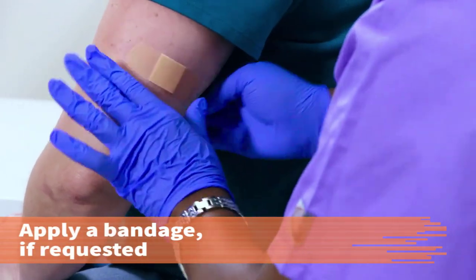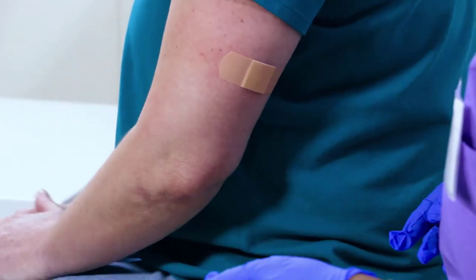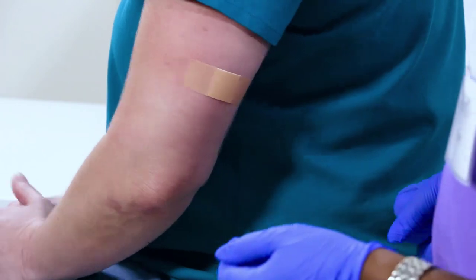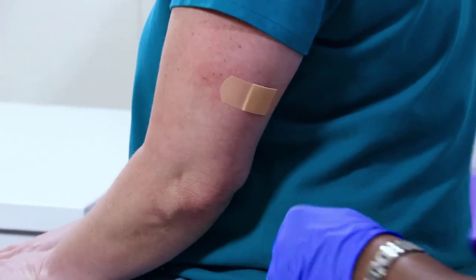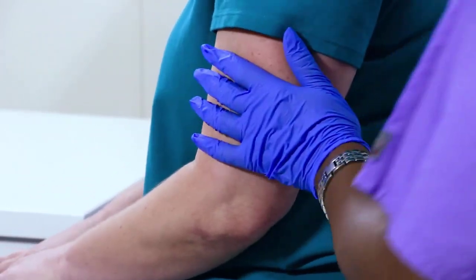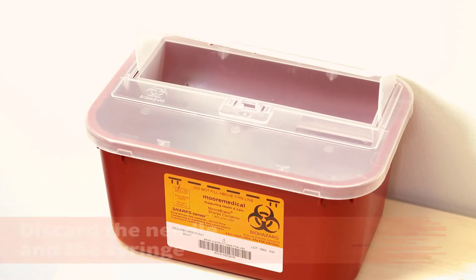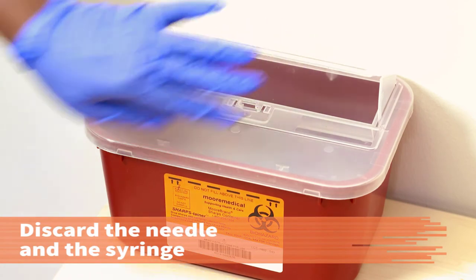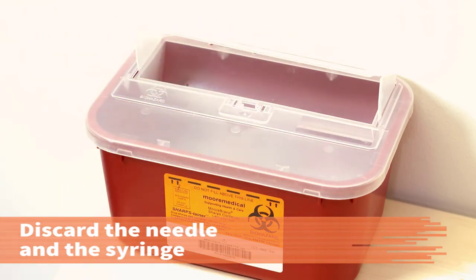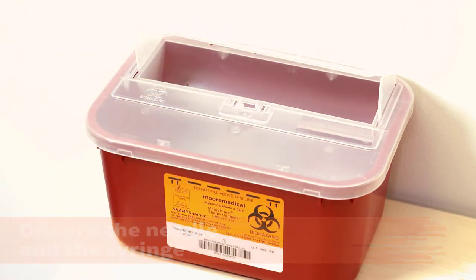Remember that some bandages may contain latex, which can be an allergen to some people, and some people may be allergic to the adhesive. Discard the needle and syringe in a biohazard sharps container. Make sure to put the needle in first.